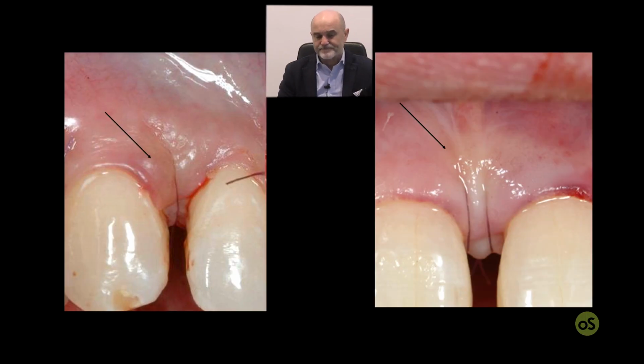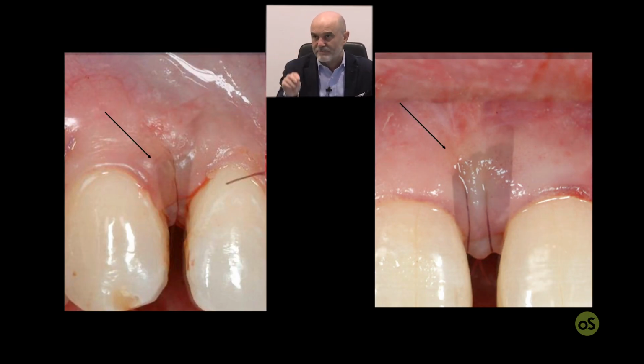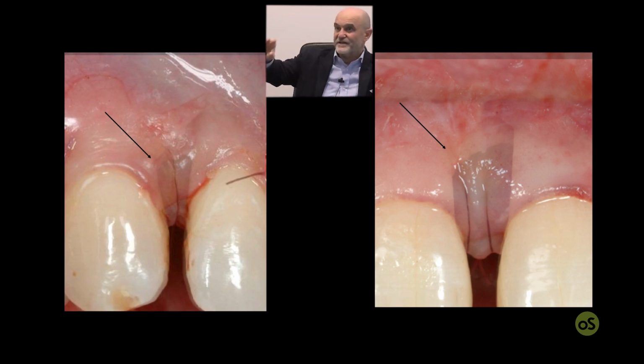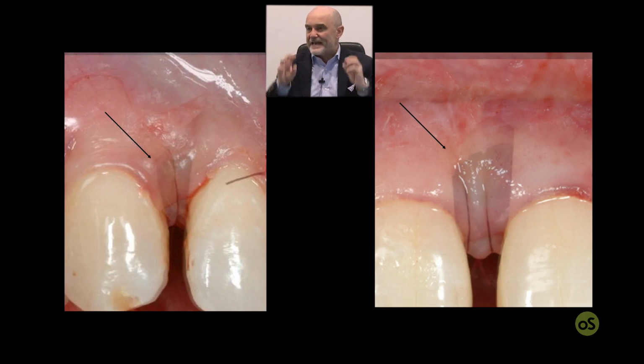And independently of where the bone crest is, and independently of whether you use bone filler materials or not, they remain in this position because they are anchored to the four adjacent anatomic papillae that sustain your flap in the coronal position and prevent your flap from shrinkage. So this is, according to me, the great advantage of the mucogingival approach to the treatment of vertical bony defects.